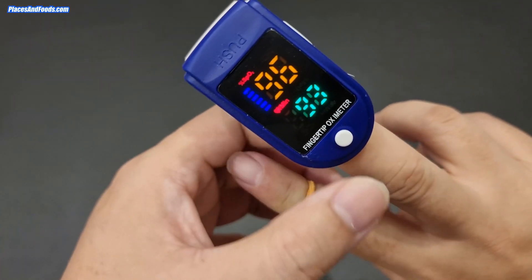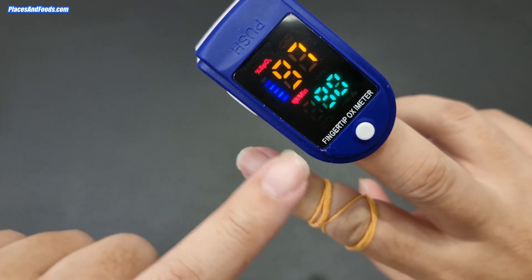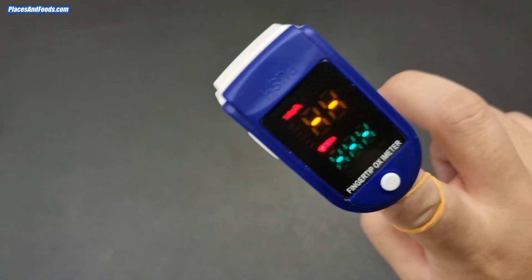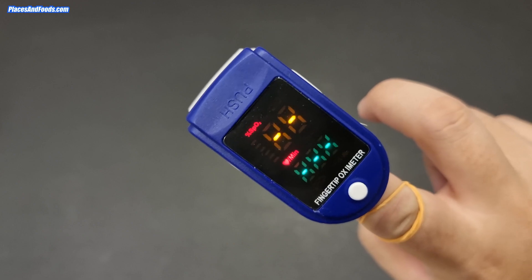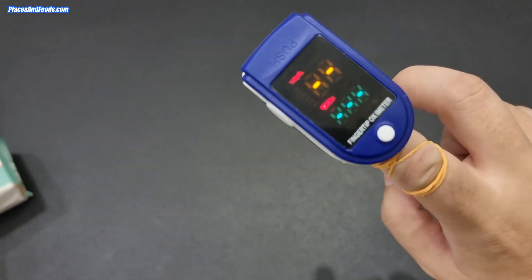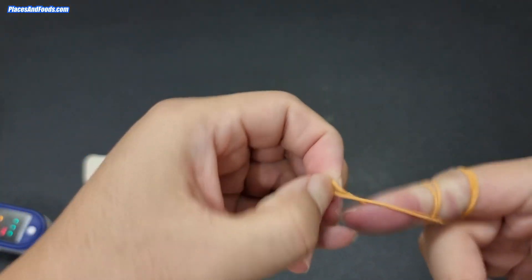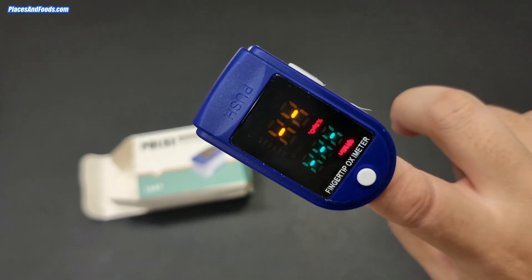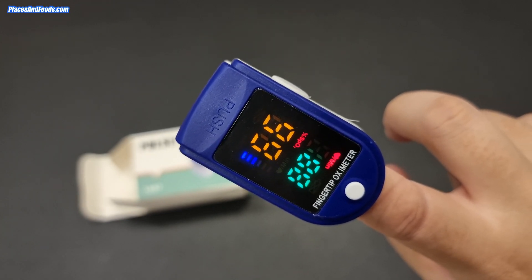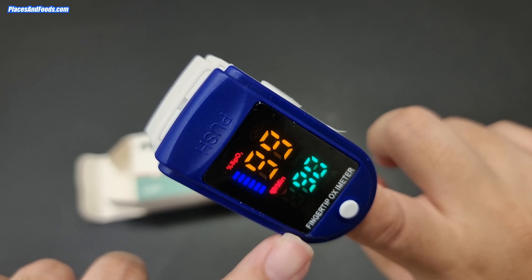Now I'm putting it on the middle finger — yeah, it just needed to be reversed. As you can see it works: it's reading 97 oxygen and pulse 90. What if I put it back to the rubber-band finger? It doesn't work at all. So basically this cheap pulse oximeter actually works, and it's less than 20 ringgit. Taking back the rubber band — wow, okay — it reads 86 at first, then reversing it back gives 99, pulse 90.